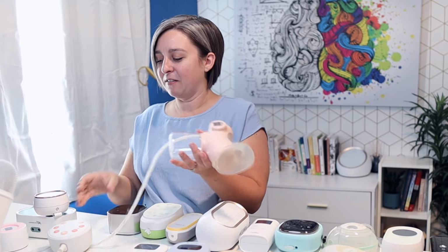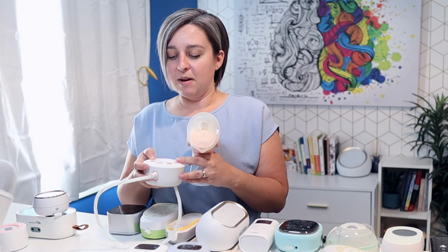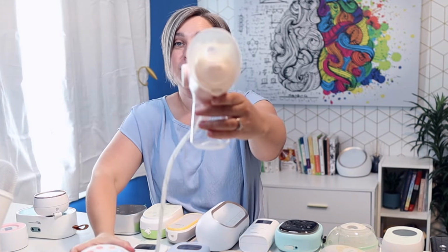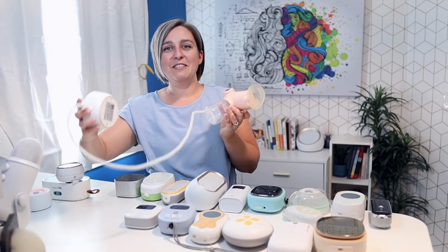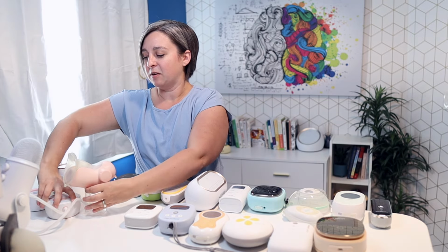And then pumps that got 0 or near 0 votes were the Annabella. Again, I think this pump is very unique. I did another video with this pump on the channel, but it has just your standard suction, but it also has this funny little tongue movement. So very unique. Again, we haven't had a ton of users that have used that yet, so I'm not surprised that it scored pretty low.